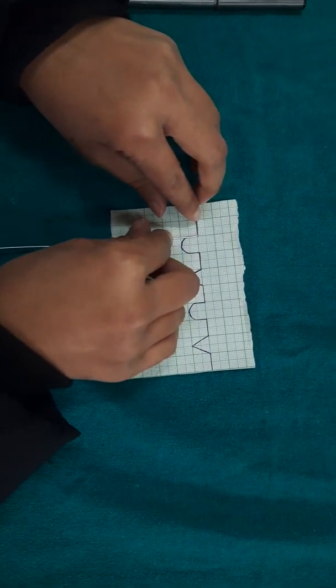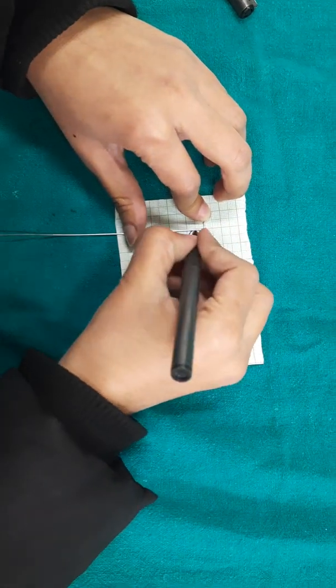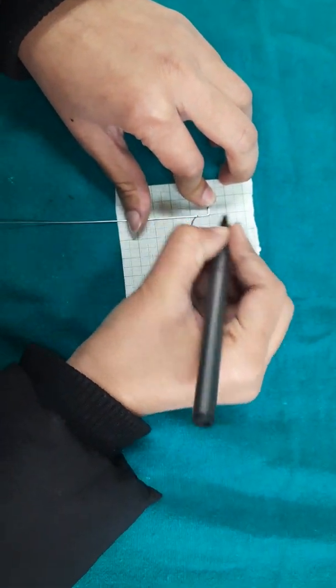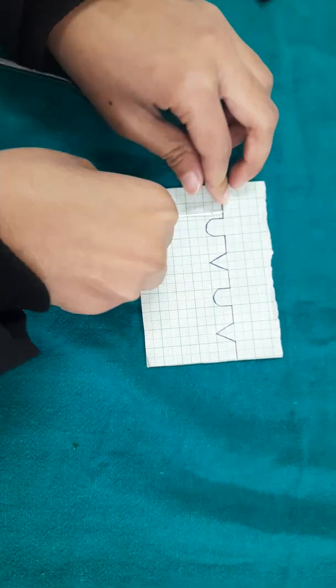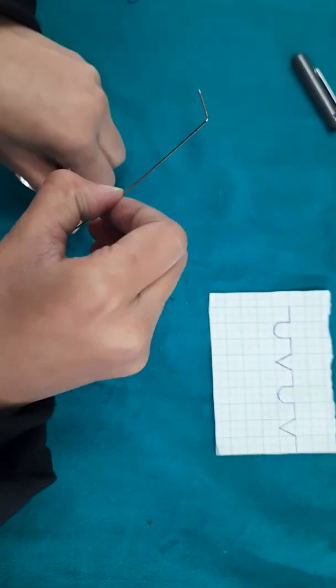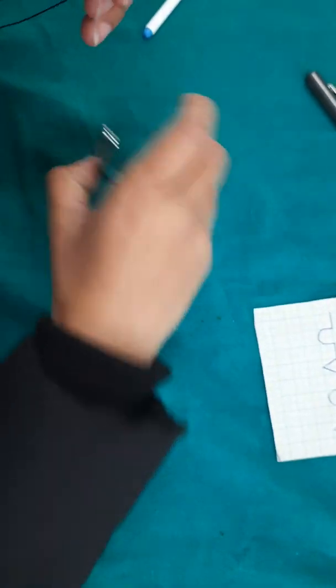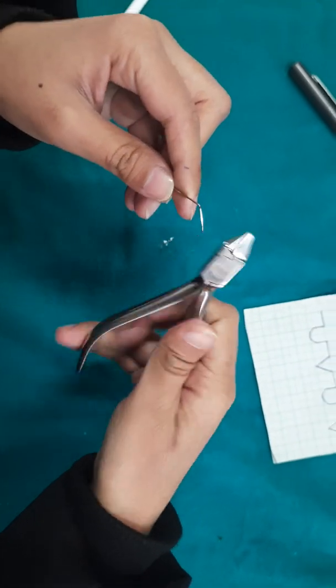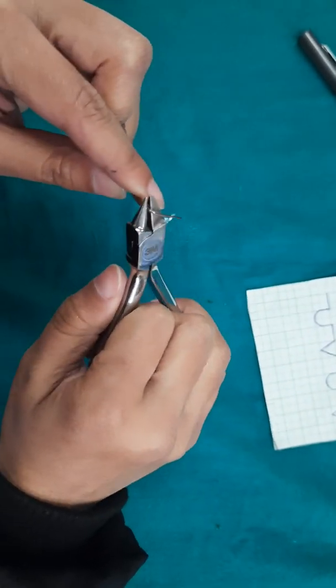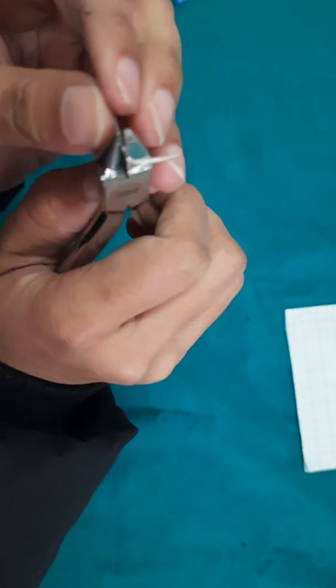Now adjust the wire on the graph paper and mark a point 5 to 6 mm away and start giving a smooth U-bend by walking the round side of the plier on the wire.